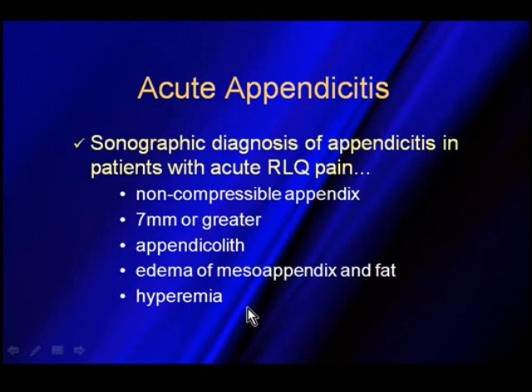So sonographic diagnosis of appendicitis in patients with right lower quadrant pain, what we look for is a non-compressible appendix.